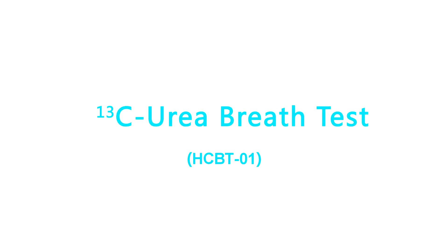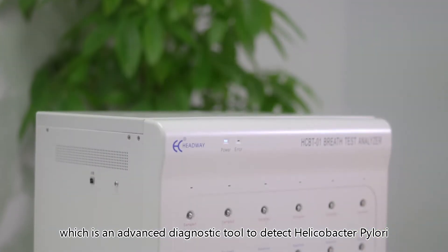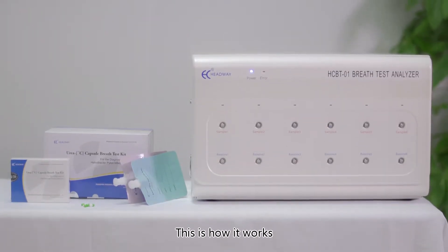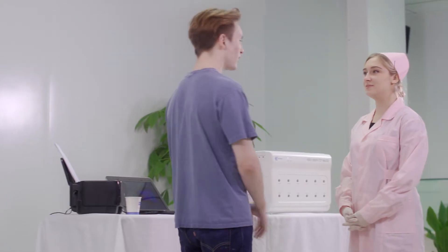Carbon-13 urea breath test HCBT01. Welcome to Headway's urea breath test system, an advanced diagnostic tool to detect Helicobacter pylori. The test is accurate, non-invasive, and rapid. Components include: breath test analyzer, computer, printer, carbon-13 urea capsule, breath test kit, drinking water, and sample collection bags.